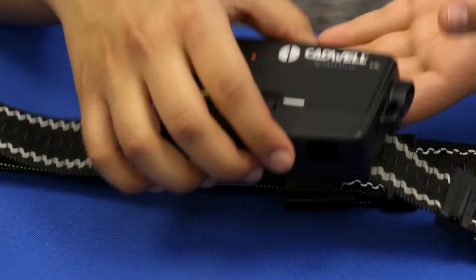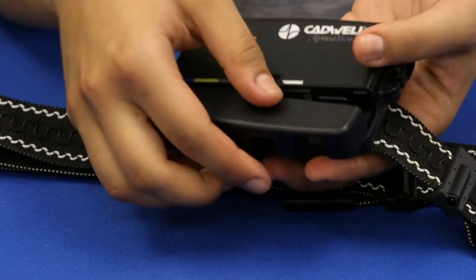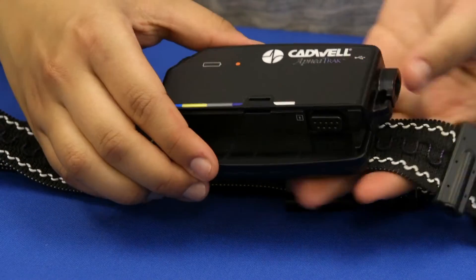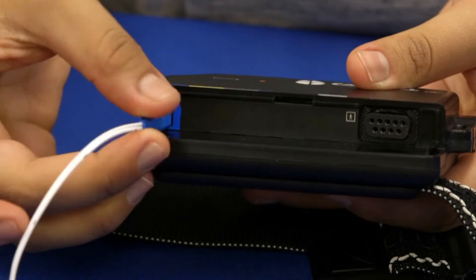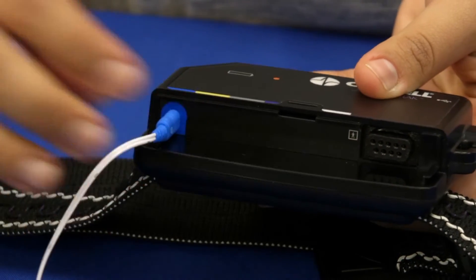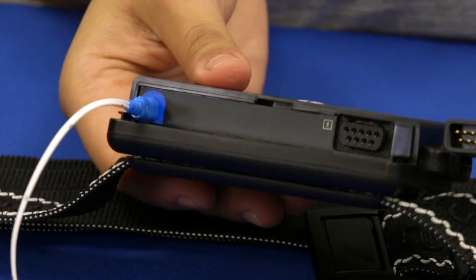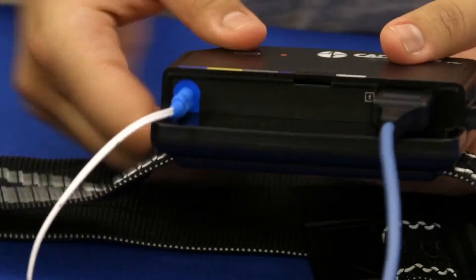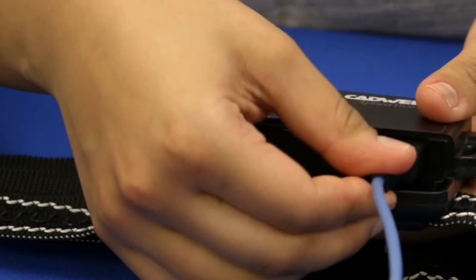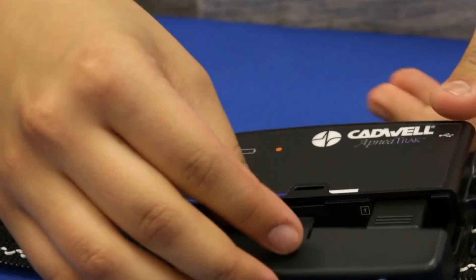To remove the port cover, press on the arrow and slide the panel down. The sensors are color coded to match the connection ports on the apnea track. Connect the blue input from the chest belt cable into the blue port. Plug the black connector from the finger oximeter sensor into the black port. Replace the port cover.